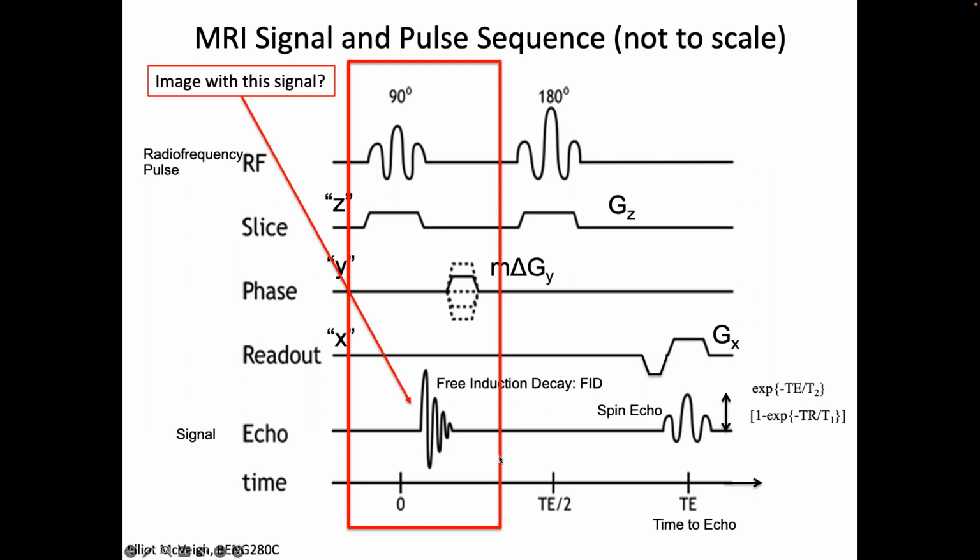And when you're doing brains with this echoplanar scanner, the nerves and muscles that it would stimulate were on the bridge of your nose. And so when it was pulsing, you could feel like a little twinge of the muscles just on the bridge of your nose, like it would buzz. If you change the slew rate by changing, say, this delta t, so it had to get up there faster, you could change it in microseconds, right?